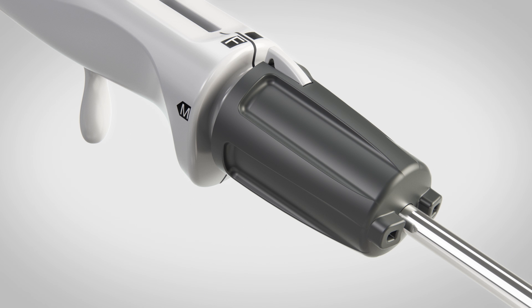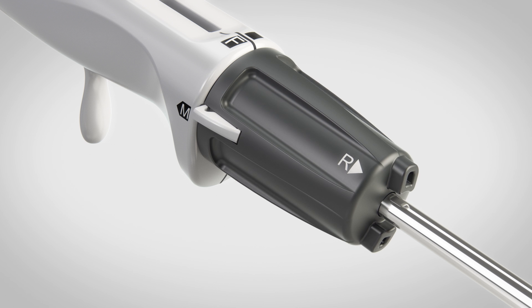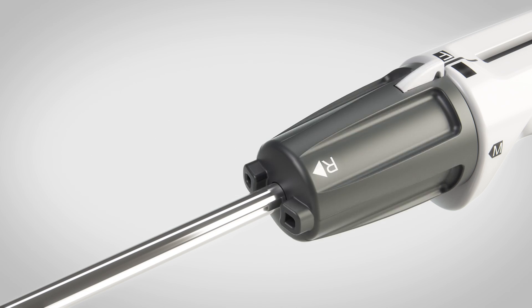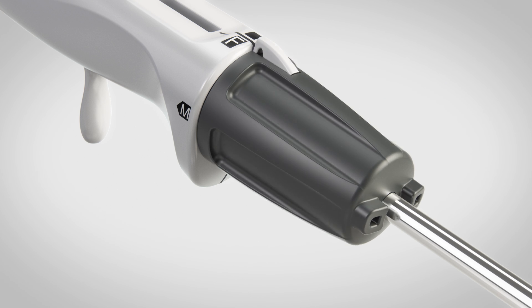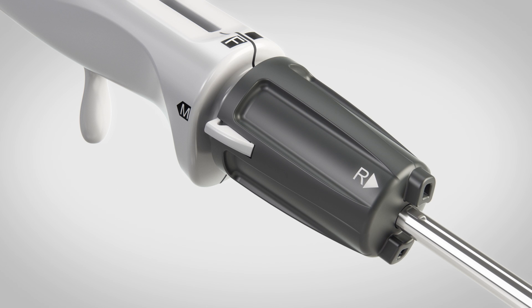For the maxillary sinus, adjust the tip orientation by pushing in and rotating the gray collar. Rotate to the left for the patient's right maxillary sinus. Rotate to the right for the left maxillary sinus.